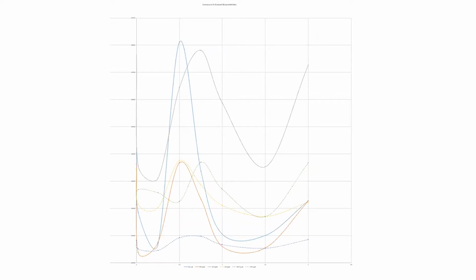We see the curve for one of the light aldehydes, butanal. In contrast to aromatic compounds, instead of a high initial peak, we see prompt decay of the curve, reflecting the drop of exhaled aldehyde concentration below the pre-smoking level. The decay after 15 minutes was followed by an early positive peak, which reached the maximum after half an hour, but after 1.5 hours, another late peak started, which reached the maximum after 2 hours. Note that highest aldehyde concentrations were observed in persons with chronic obstructive pulmonary disease.